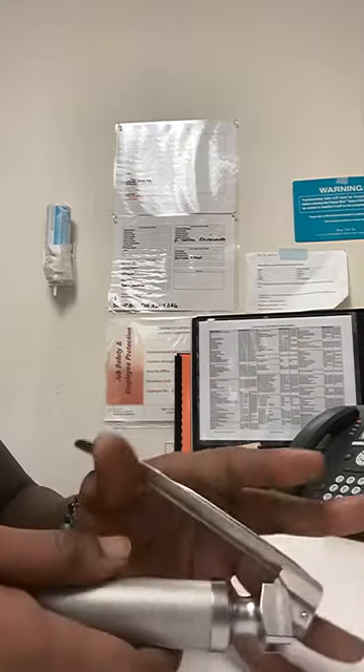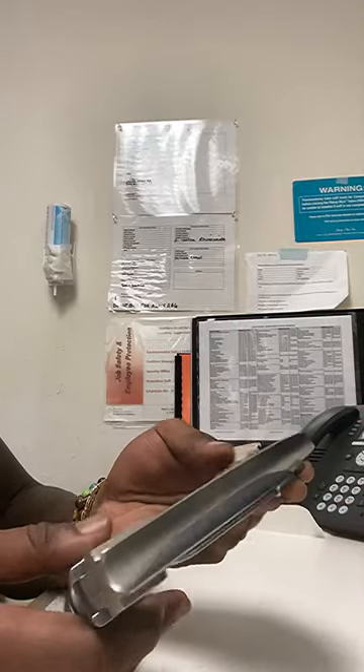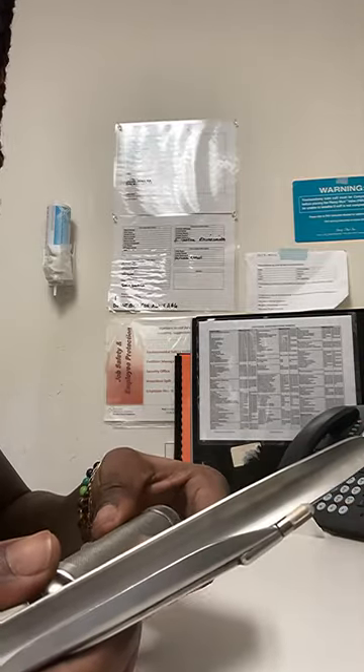This is our laryngoscope. It's a Miller. You can tell it's a Miller because it has the straight blade. Mac usually has a curved blade.